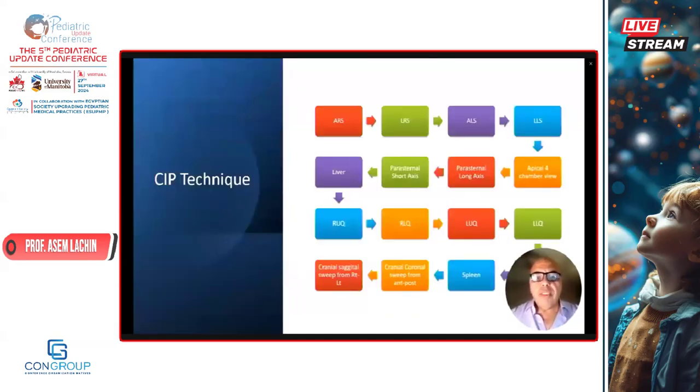We mentioned that the most common causes of crashed infant are around 16 causes from different systems. Here we also have around 16 steps or sweeps to be done within 10 minutes in our crashed infant, using ultrasound skills to figure out the reason and a physiology-based understanding of the deterioration, and of course affecting the decision for management.